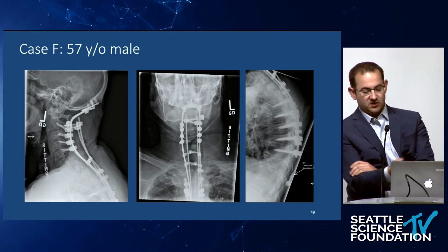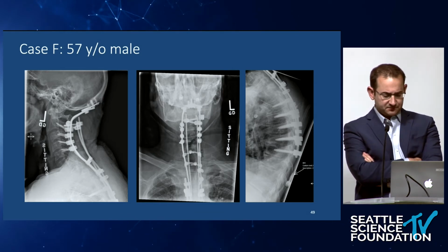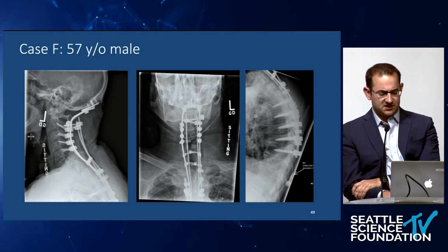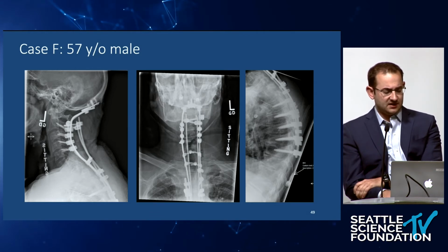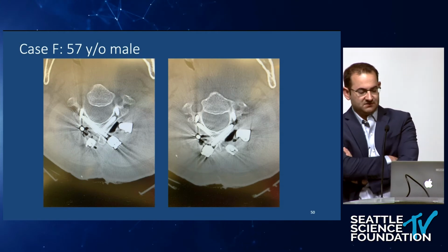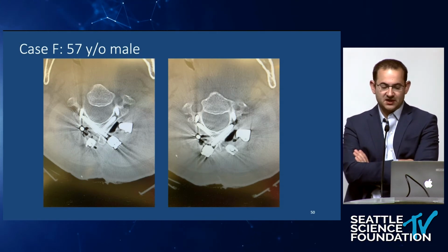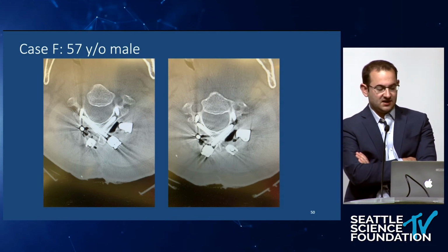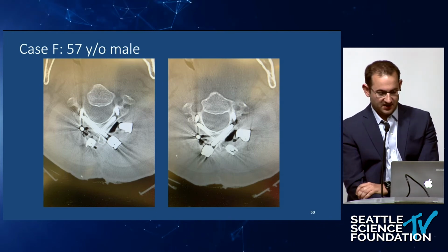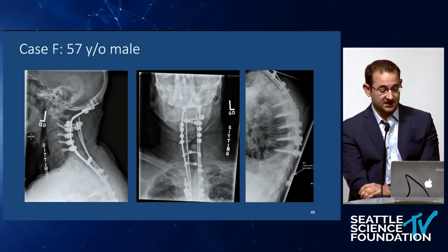there was a lot of areas that weren't even instrumentable, but I went down to T6 or so, or this is even T8, I believe, and did dual rods with dual maximal fixation into C2, as you can see. I filled every little crevice I could with screws, and I was able to get him out of the halo immediately, and he was extremely happy.